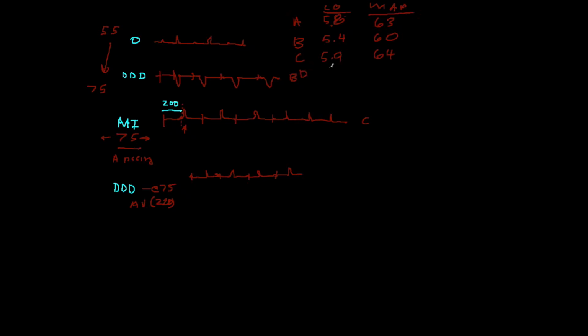And again, that's going to give you, when you bother measuring it, similar cardiac output and blood pressure.